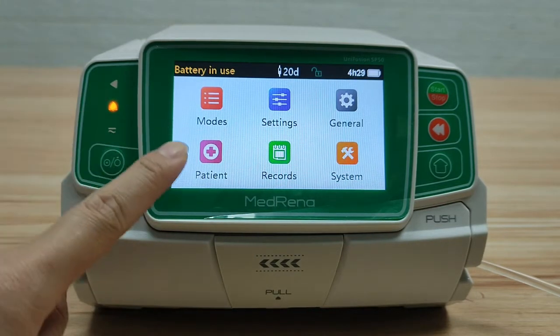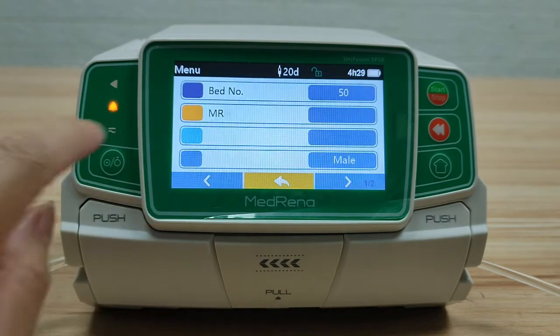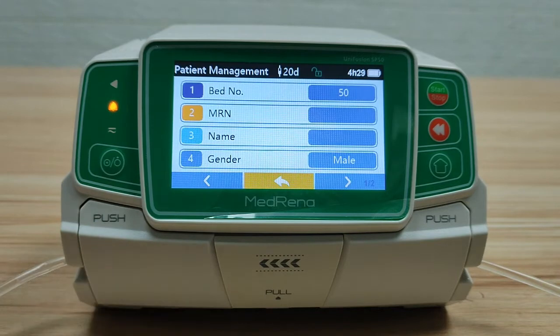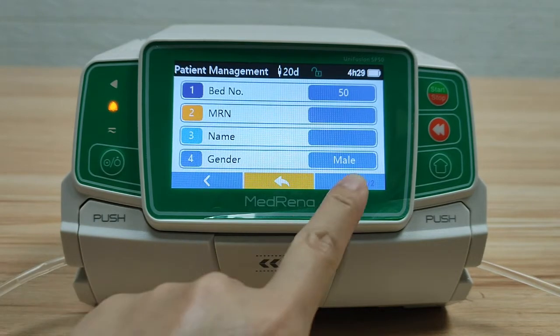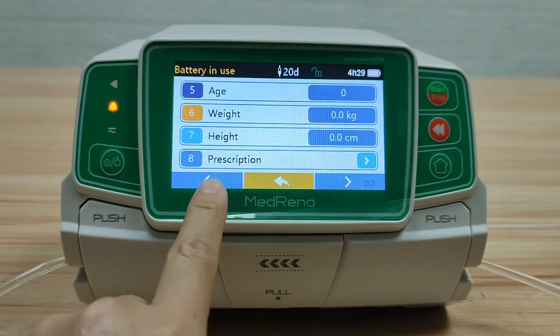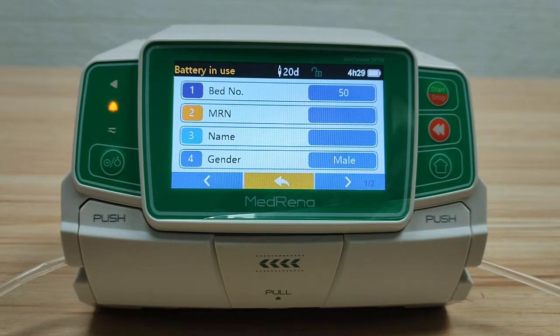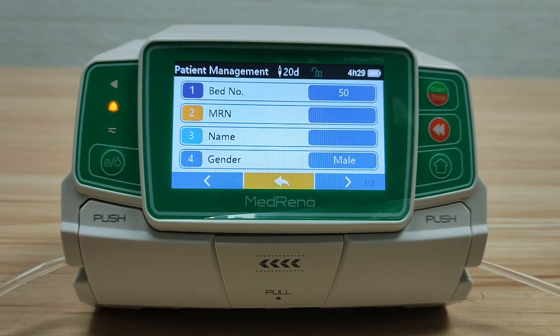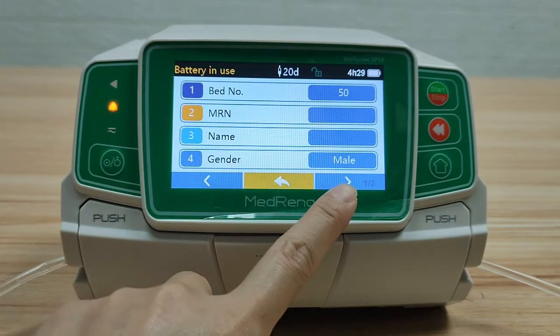Next, let's look at Patient. In this two-page section, we can edit the basic information about the patient.